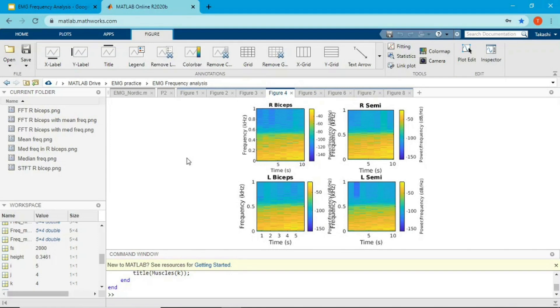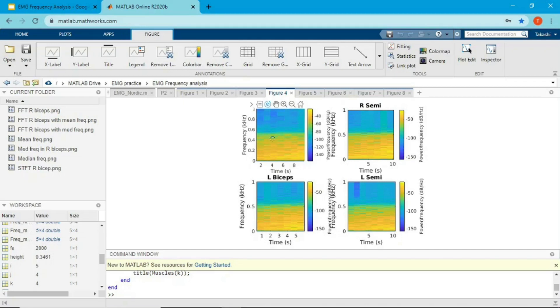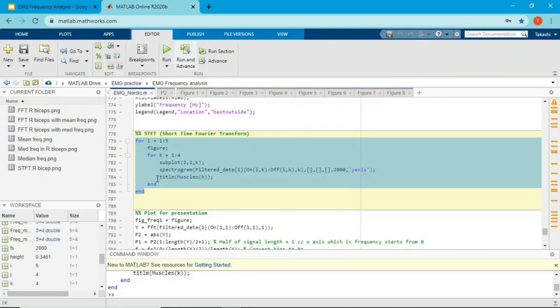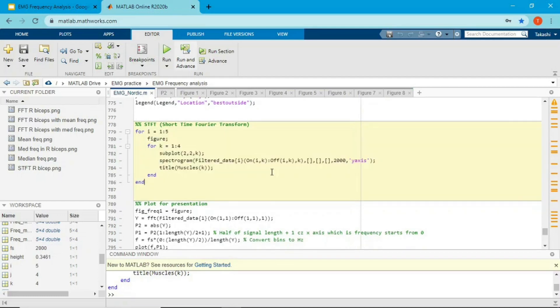In this spectrogram, y-axis is frequency and x-axis is time. Unlike the previous FFT plot where you didn't see the time component, here you see frequency, time, and amplitude represented by color. You can also rotate this plot since it's 3D.